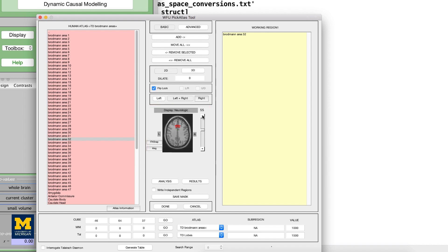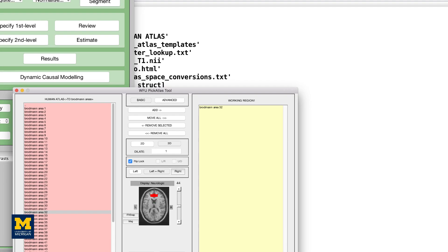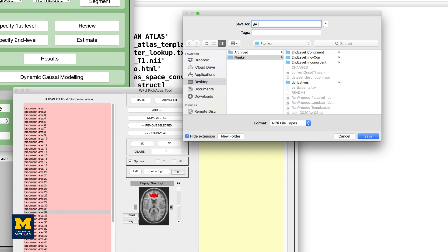You may think that the mask is too thin to adequately capture your region of interest. In that case, you can enter a number in the dilate field and click either the 2D or 3D buttons to dilate the mask by the number of voxels you specify in either two dimensions or three dimensions. Enter a value of 1, and then click 3D, and observe how the size and extent of the mask changes. Now click the Save Mask button near the bottom of the screen. Let's call this mask BA_32, and save it to the Flanker directory that contains all of your subjects.